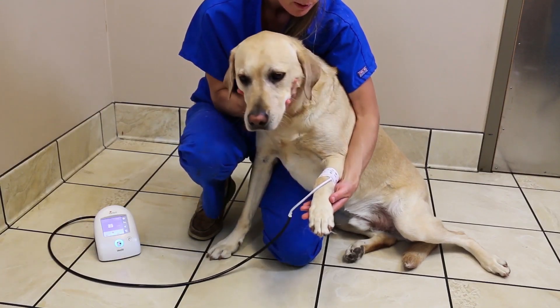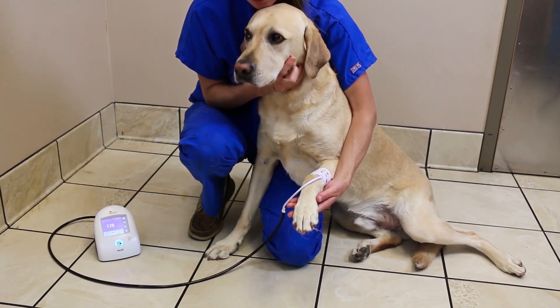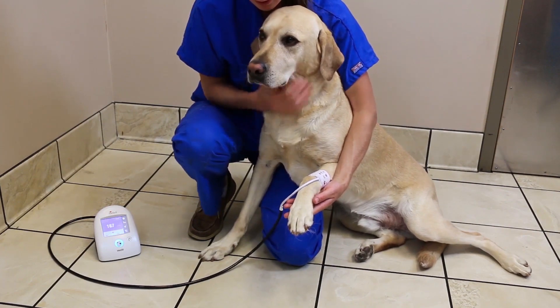The speaker is turned off by default and the monitor operates quietly so that the sounds do not frighten the patient. If desired, the speaker can be turned on.